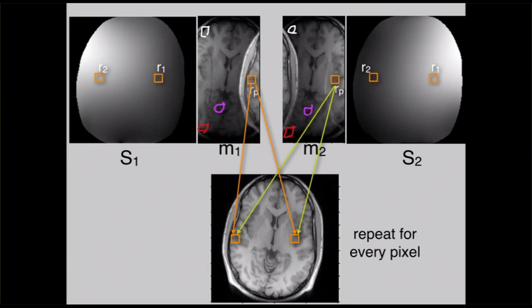Okay. And so basically, I'm going to have a bunch of these small matrices that I need to invert, and then I'm going to solve and recover 2 pixels at a time here, right? And put them in the right place. And that's a very simple reconstruction, right? Like it could be efficient, very parallel, very nice, right?